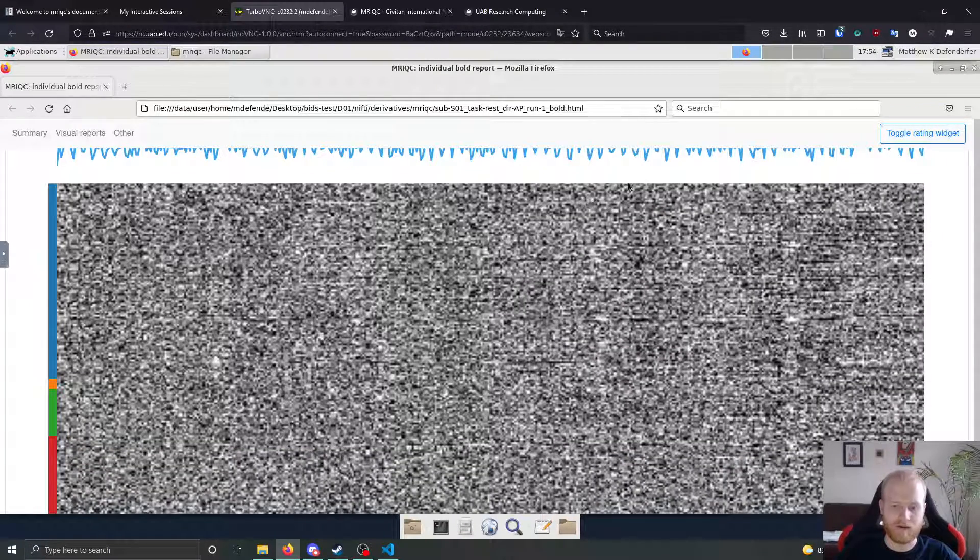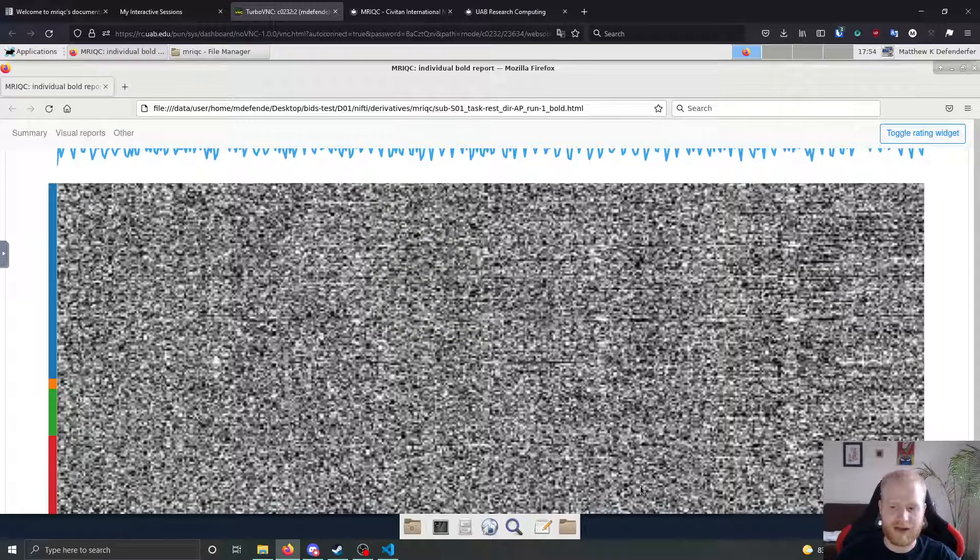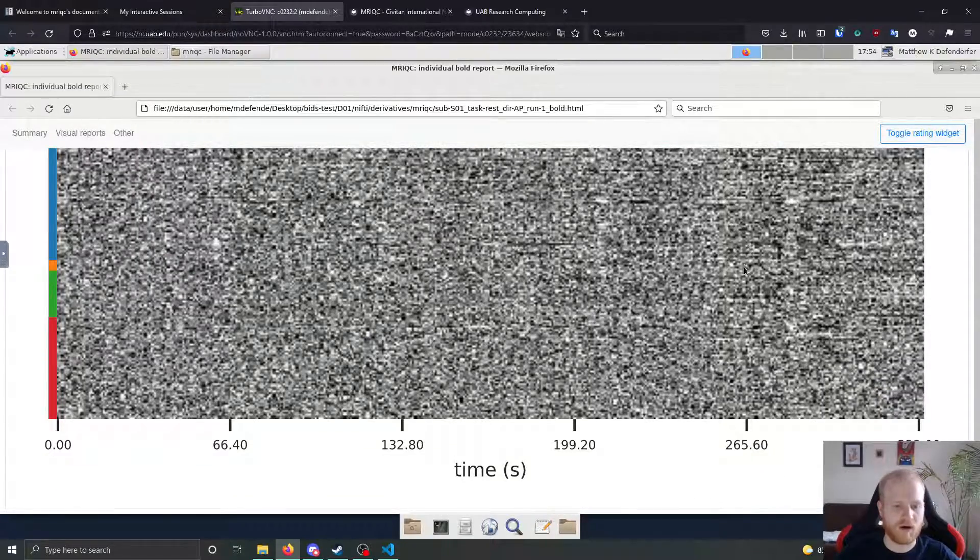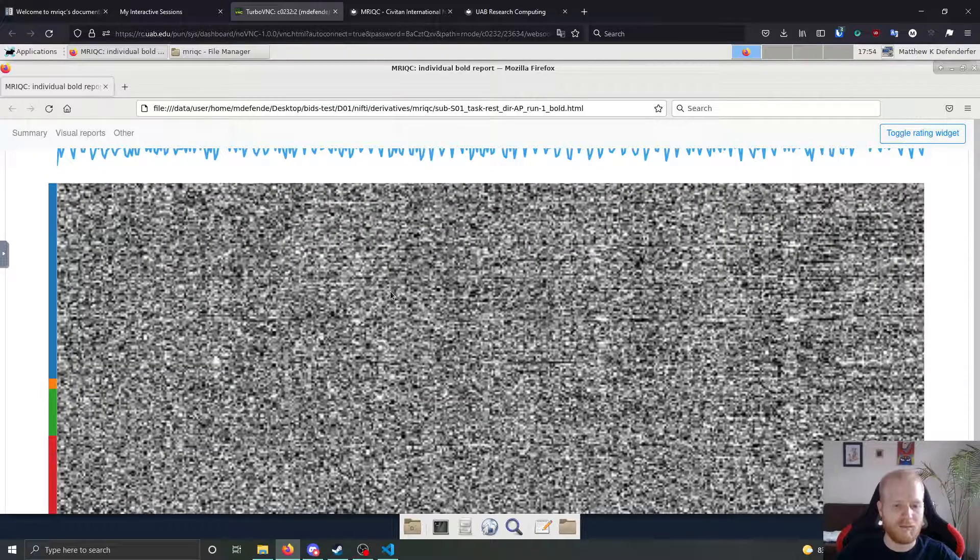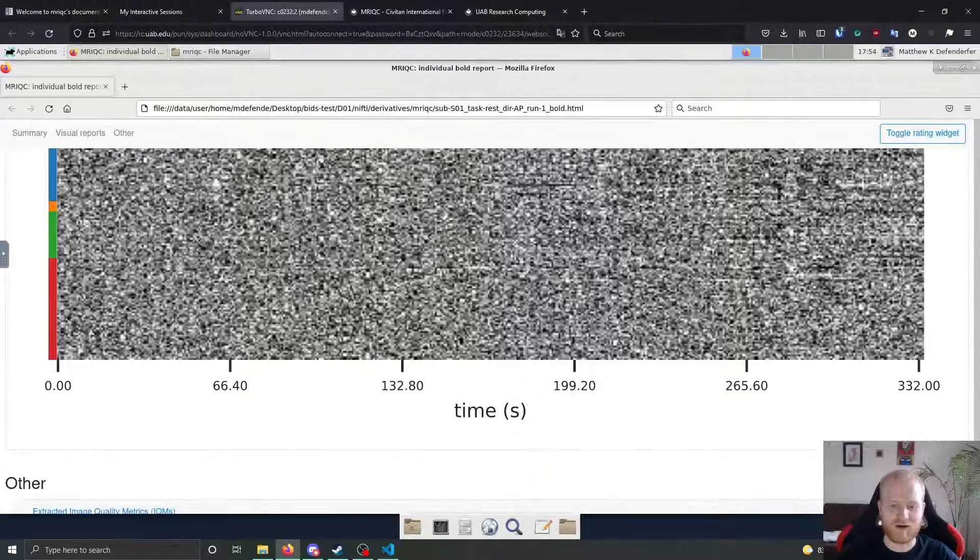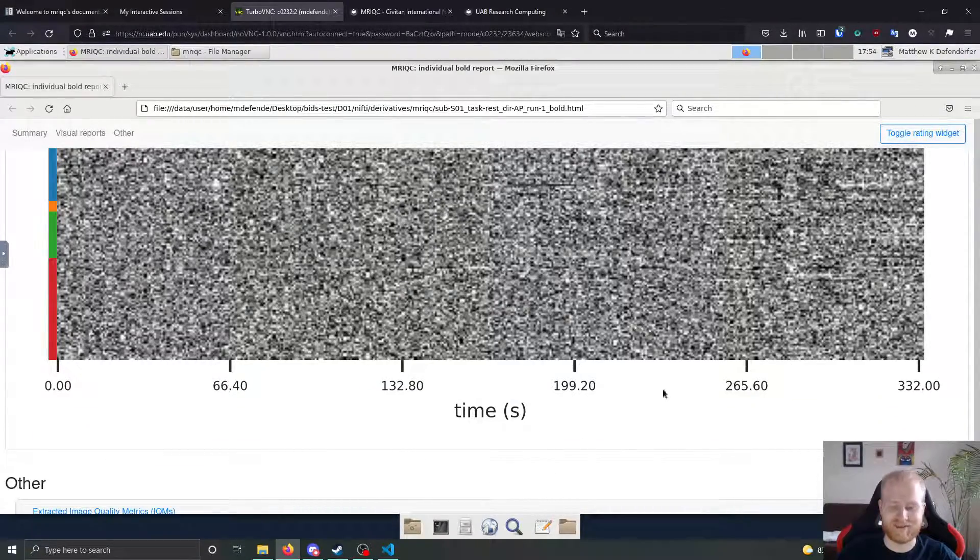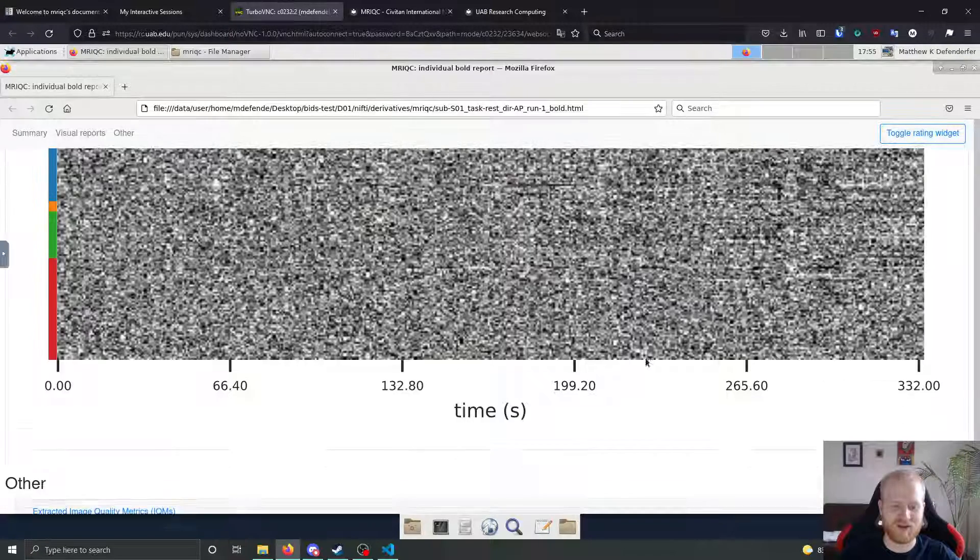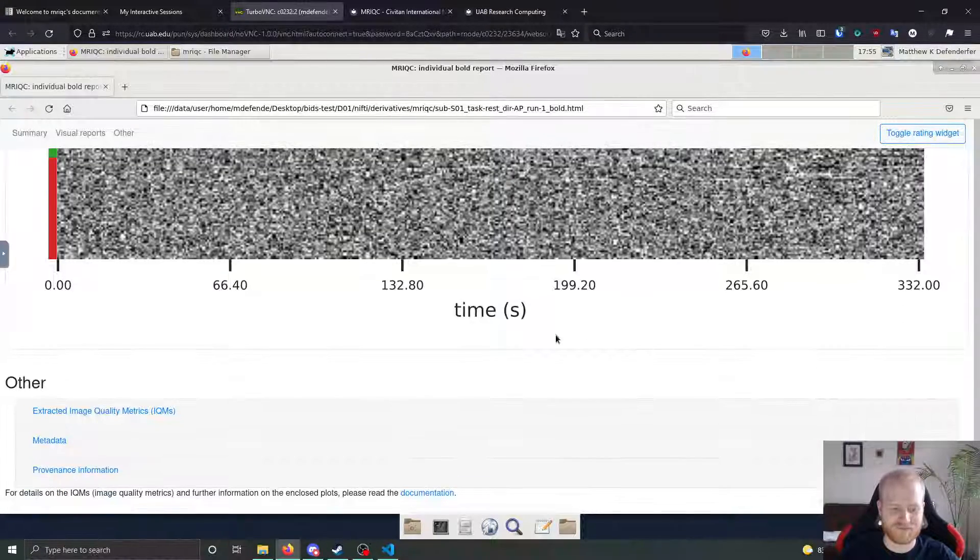As well, it gives you a carpet plot so that you can see if there were any large scale artifacts at various moments in time. This one looks pretty good overall. But if there are some pretty noticeable artifacts, you'll be able to see them in the carpet plot generally as well.